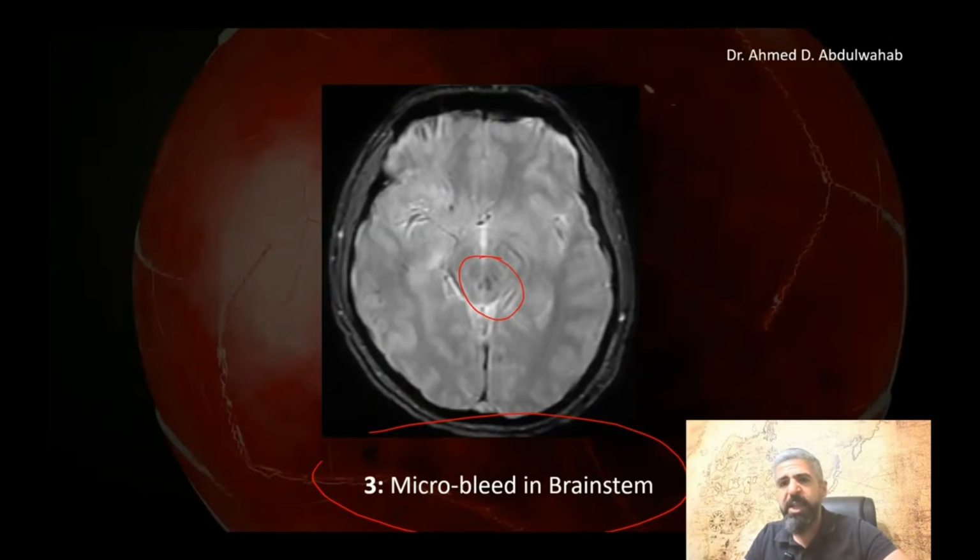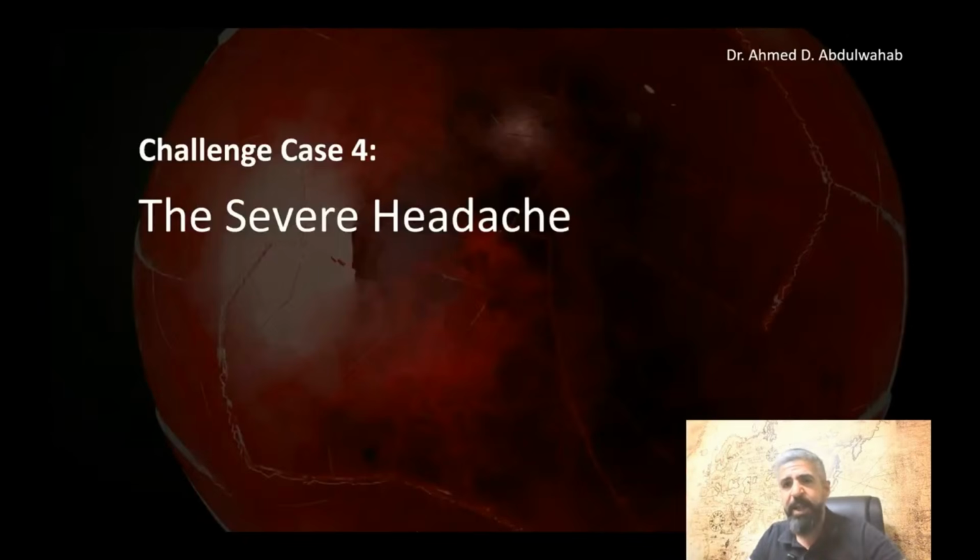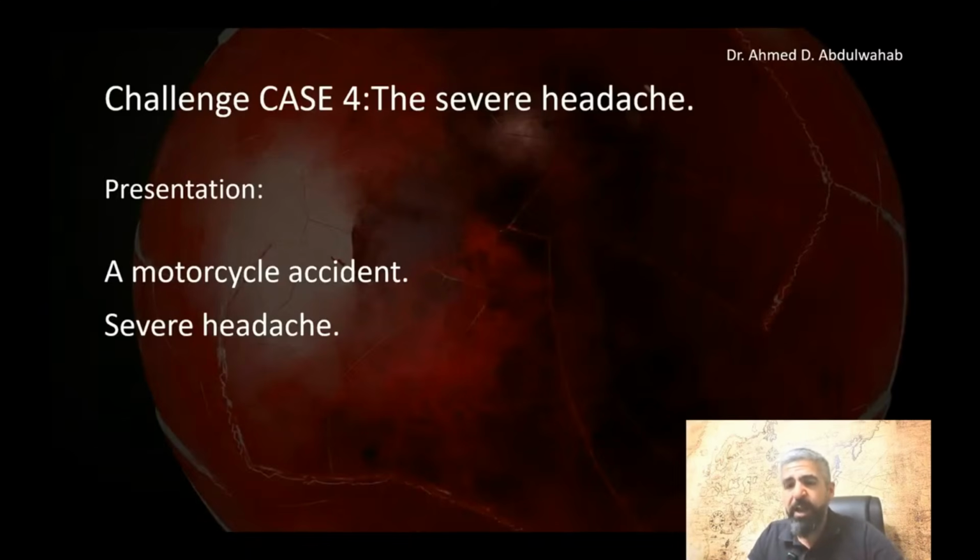Let's go to challenge case number 4. It's called the severe headache. Now, this is a motorcycle accident. Patient presented with severe headache. He said it's the worst headache he had in his entire life.